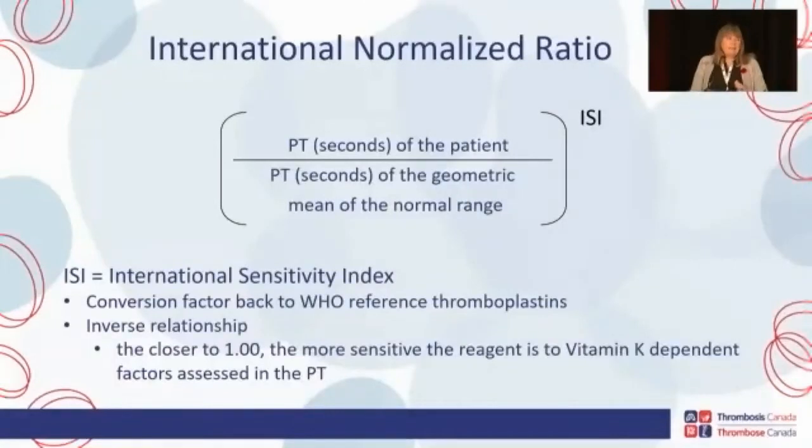This results in a PT in seconds being determined. For warfarin monitoring, we have moved to the international normalized ratio, in about 1998.